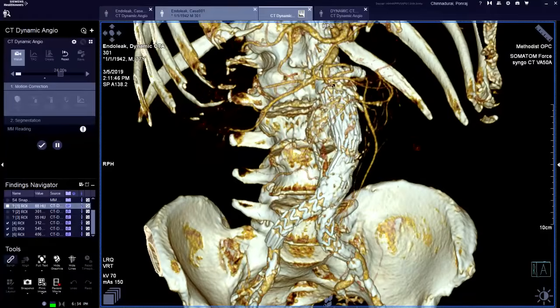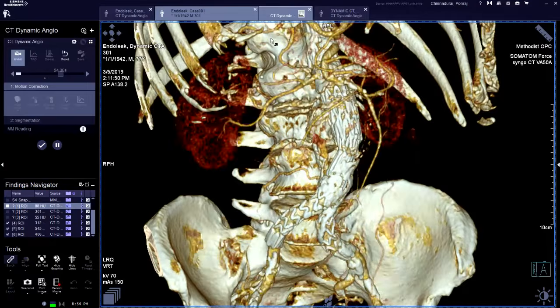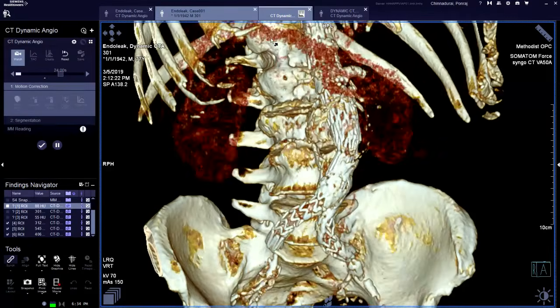In the early arterial phase, SMA filling, and you get the SMV and the portal. That is already a good indication that we covered pretty much the entire contrast kinetics from the arterial through the venous bed. Here we are seeing contrast filling from this L4 lumbar, getting into the sac and then exiting out through here.